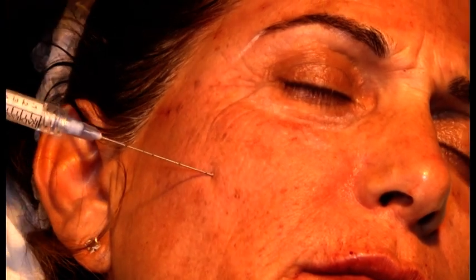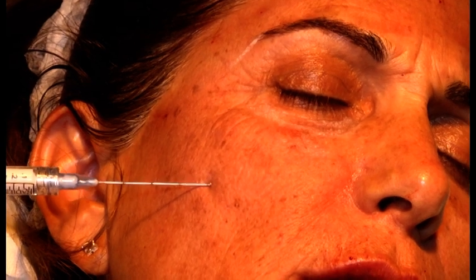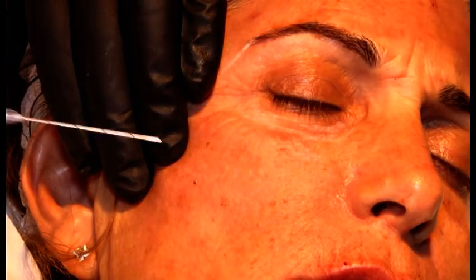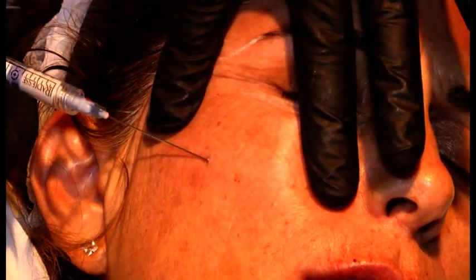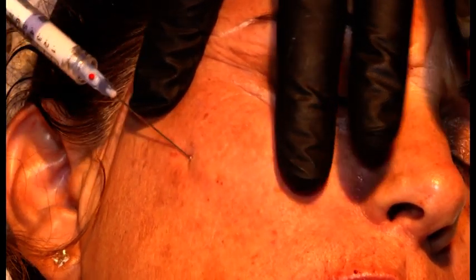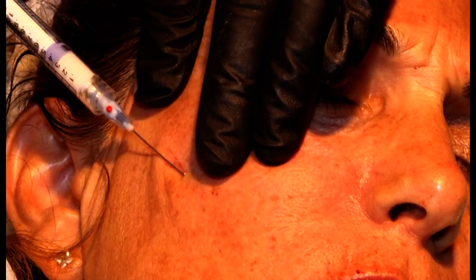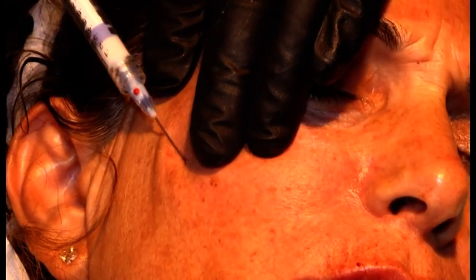Alright, so these were the lifting injections. Now, you are completely right, there's still a bit of hollowing over here, and that I can treat with subcutaneous retrograde linear threads over here, over here, over here.